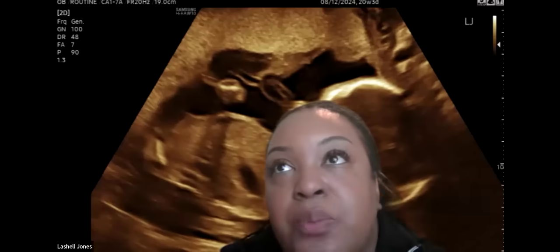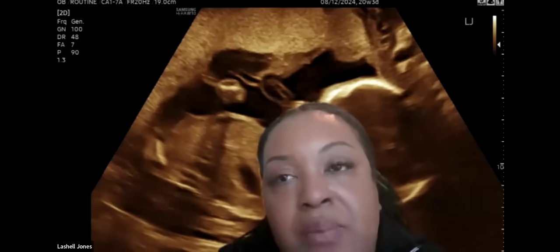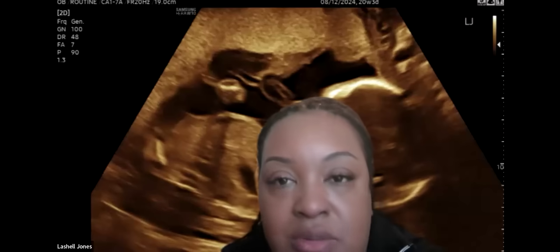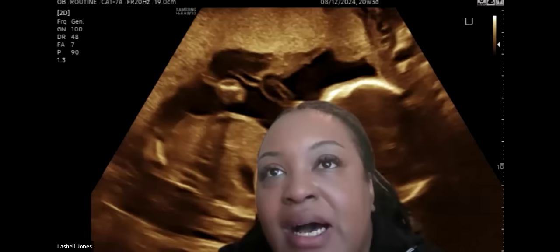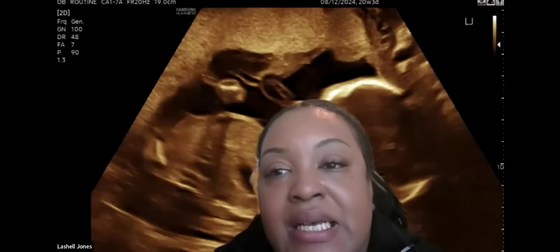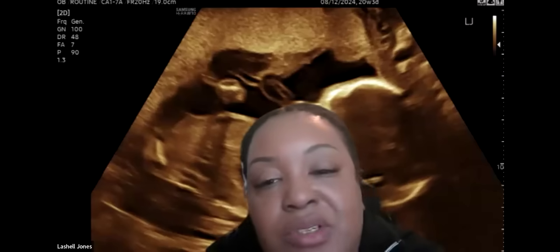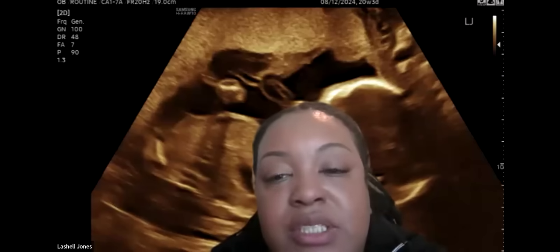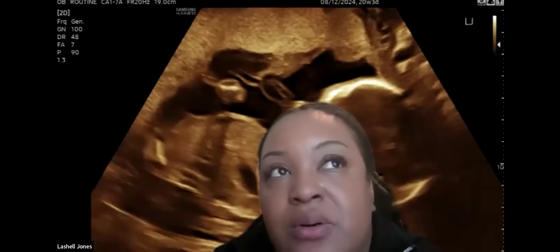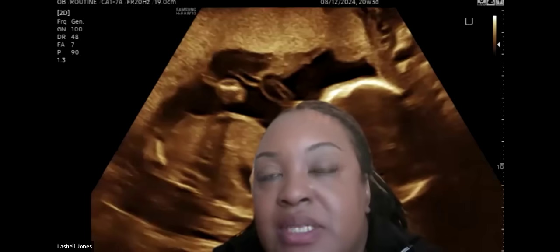But I feel like once you get to your 20-week mark, they don't necessarily push the screening test any longer, and we just follow what we find on ultrasound. If it resolves, it resolves. I wish I had looked back to see if there were subtle signs that might have gotten overlooked, because that could have been the case. But it's still helpful to pick up.